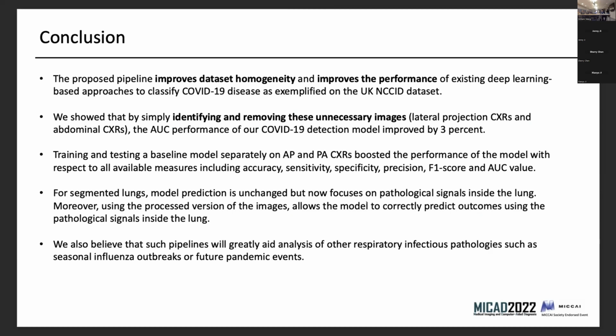Thanks a lot for this presentation. I have one question regarding lung segmentation. I found many interesting papers in the last years regarding the segmentation of lung parenchyma. Usually the researchers show pictures of healthy lung parenchyma segmentation, which is kind of easy to do. But when you see really heavy COVID pneumonia or atelectasis, you kind of see that the segmentation model doesn't know what to do. What factors should they take into account?